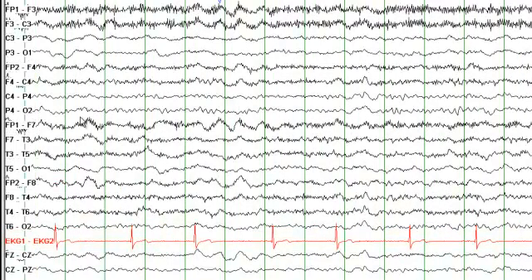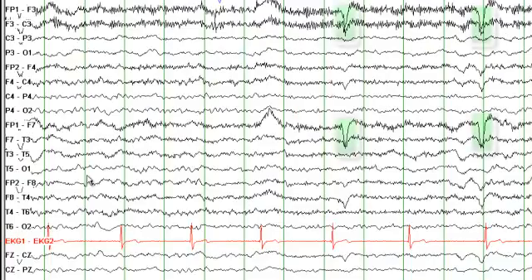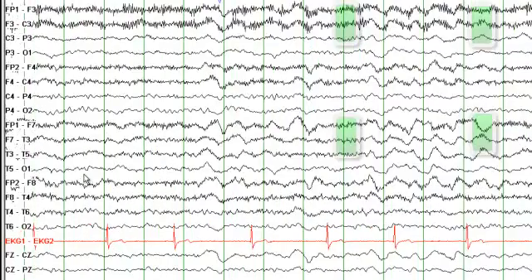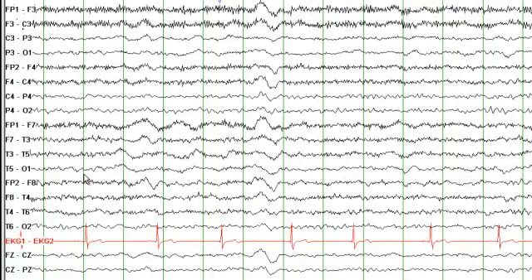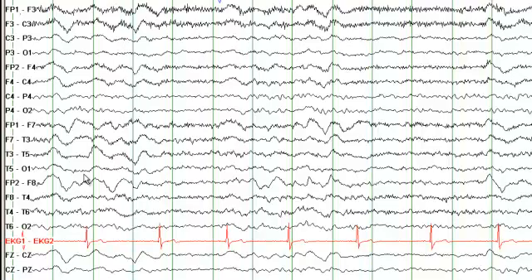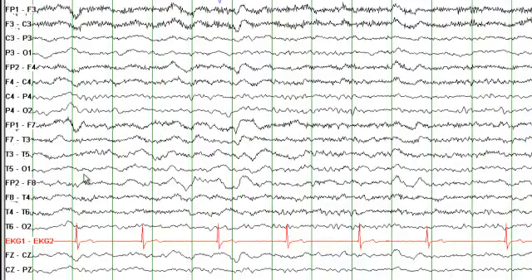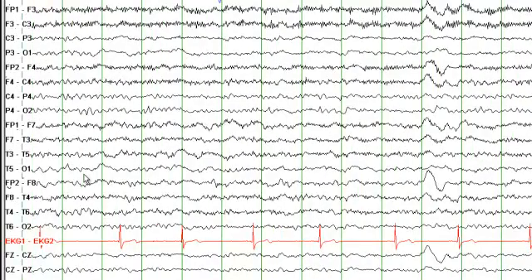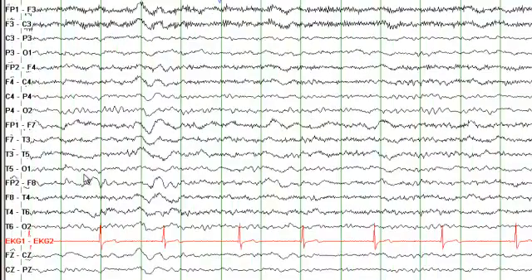Try to compare the left hemisphere with the right hemisphere. See if you can identify a posterior dominant rhythm — look in the posterior channels. Try to identify the state of the patient: are there some clues whether this person is awake or asleep? Do you see any abnormality? Is it lateralized? Is it localized? Make sure you look through all the channels. The most important information may be in a place where you are least suspecting to find it.